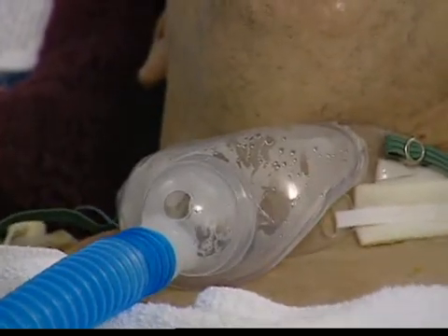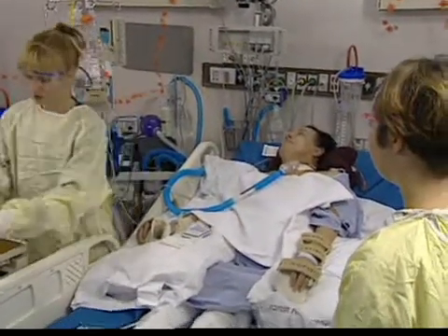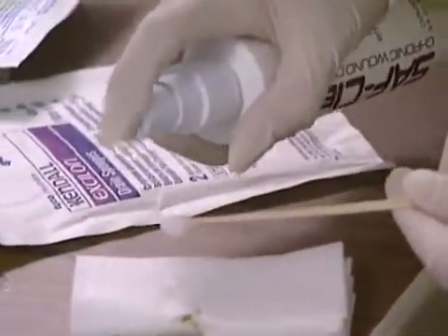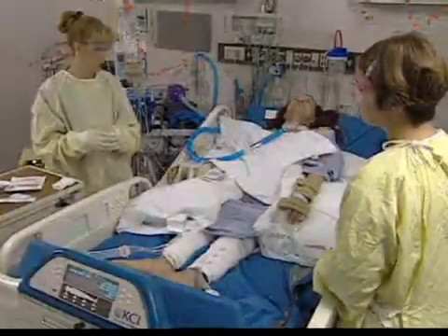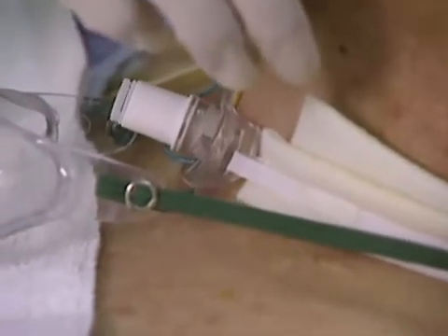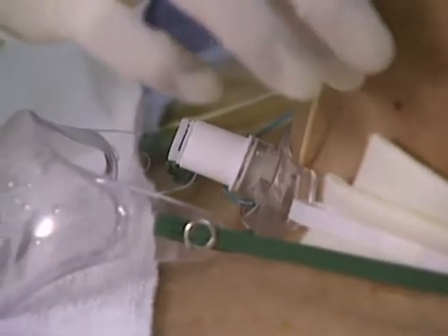Prepare your other supplies on the bedside table. And Jenny, I got these cute long Q-tips, and I have my Safe Cleanse, and I'm going to get them moist. And as I start, Mr. Gonzalez, can you turn your head towards me, please? Thank you. So we're going to insert at the top, get down to the tube, and roll it as I drag it across the top of the trach.